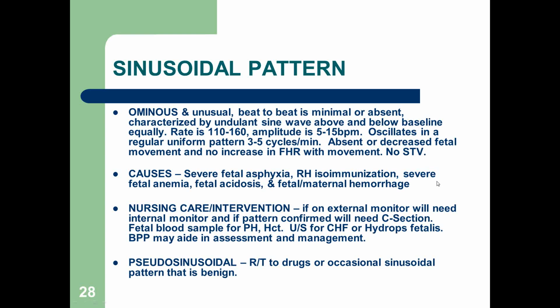Some sinusoidal patterns. These are ominous and unusual, and that means the beat-to-beat variability is minimal or even absent, okay? And it may be because there's no fetal movement, and it may be due to fetal asphyxia or fetal anemia. You've got a baby in distress, okay? If on the external monitor, they'll need an internal monitor, and if the pattern is confirmed, they'll need a C-section, okay?